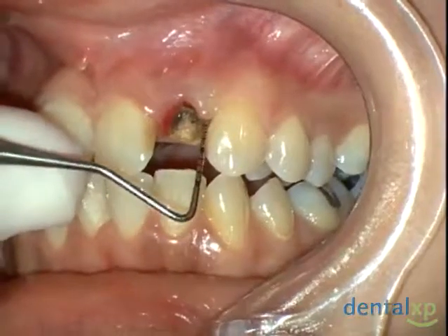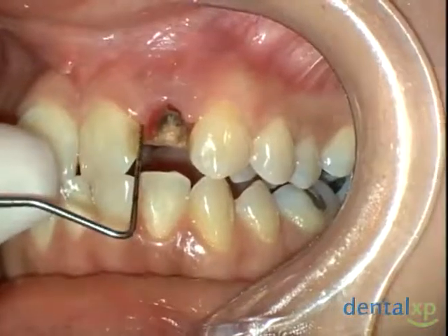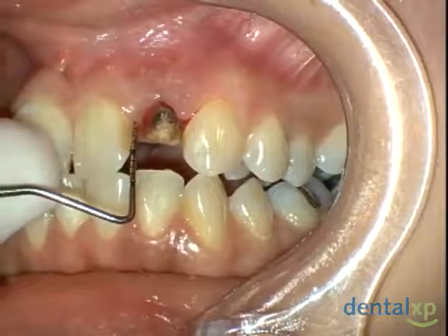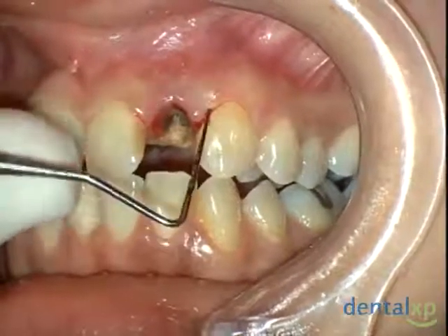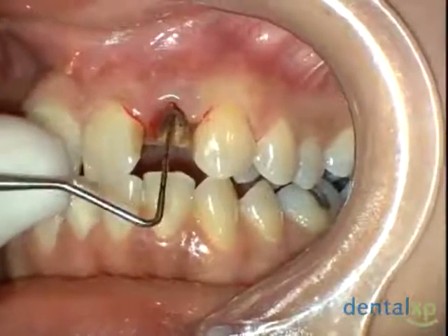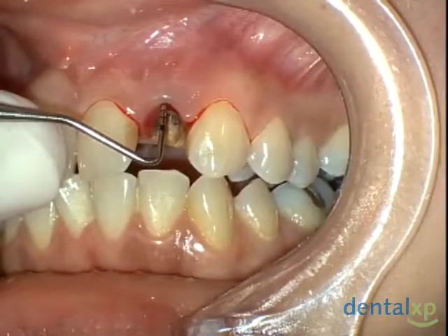What we're doing now is simply probing down to bone interproximally and seeing that we're about 5 millimeters to 5.5 millimeters from the contact point on the mesial aspect of the left canine, as well as the distal aspect of the maxillary left central incisor. This is important information, as now we can predict the possible shrinkage of approximately 1/2 millimeter of tissue interproximally down the road.